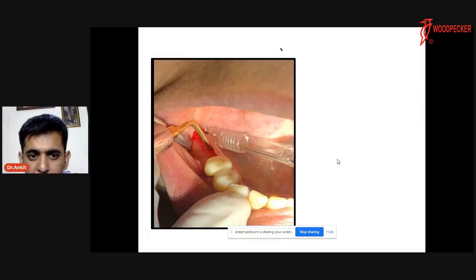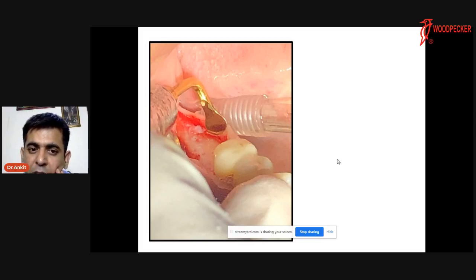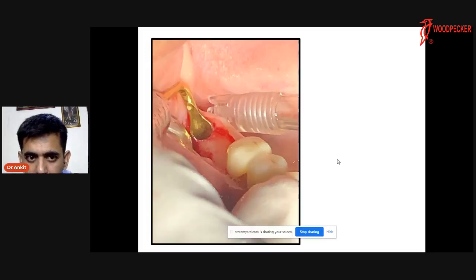So what we do is, we take our rounded bar, which we have already seen in our previous diagram or previous sections or previous cases. Similarly, we will be doing it in the cases of bone contouring. And after doing the bone contouring, this is the leveler bone. Whatever rounding off we have seen, and which we are done with that round bar, still we can level it up, so that we have a stable bone around the fixture to be placed for the future fixtures. So in such a scenario, we need to make sure that we have done bone leveling in and around the implants, right? So you can level it up, you can properly level it.